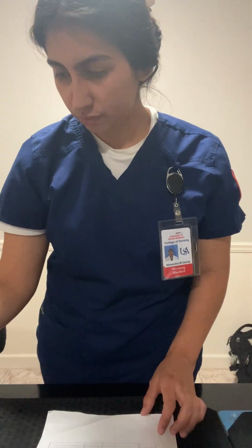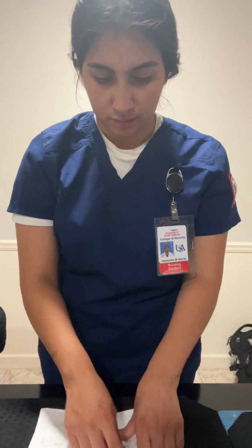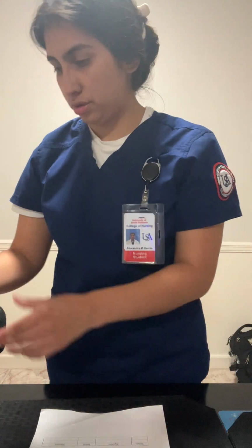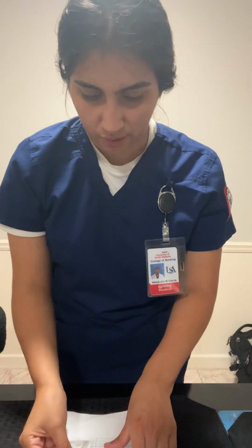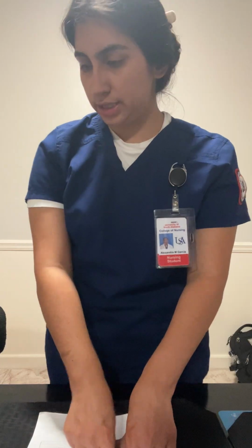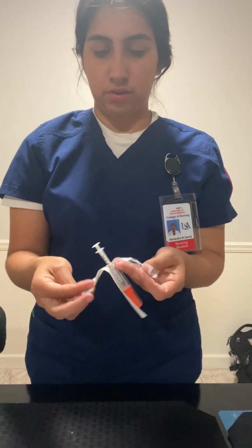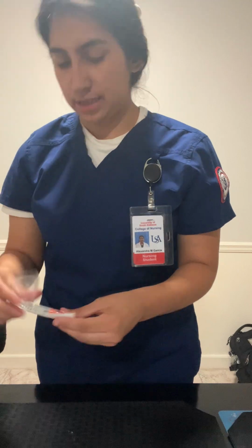Okay. Now the right route, which is subcutaneous. Now I'm going to grab my syringe, show it to the camera, and compare it to my MAR: subcutaneous. Okay, now right dose, which is 10 units. I'm going to open my syringe.